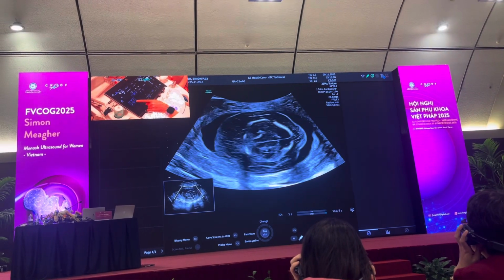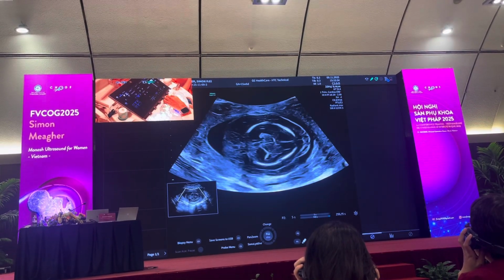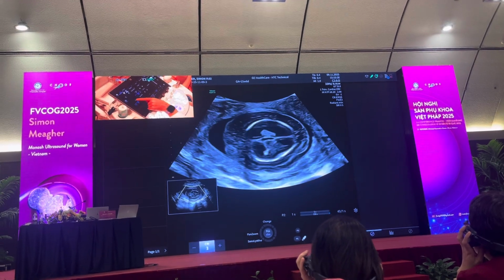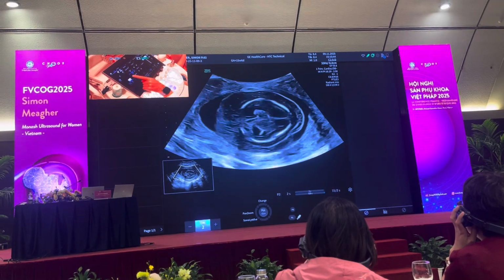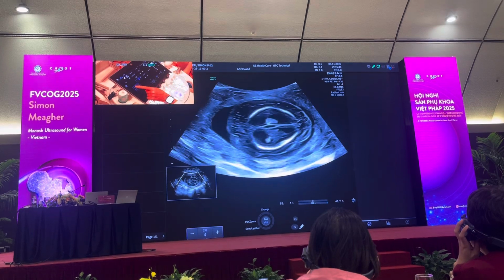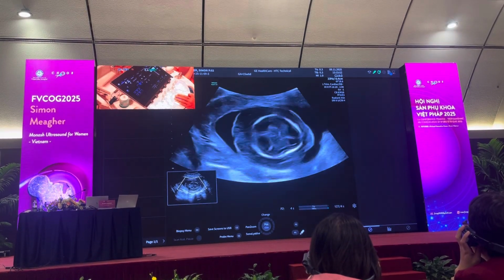As you look at this section and this image here, the next control I'm going to change is speckle reduction imaging, SRI. So I'm going to increase my SRI up to 5. I'm going to slightly increase my gain. And then my compound imaging, I'm also going to see if that makes any difference. I've got a compound imaging setting at 3, up, compound, too much. Okay, so I've got a compound image setting of 4 and an SRI setting of 5.